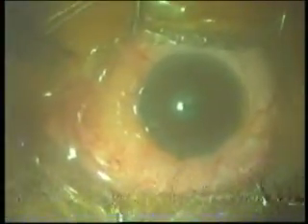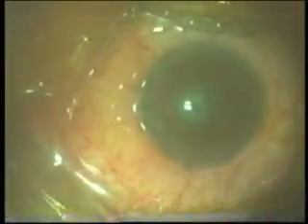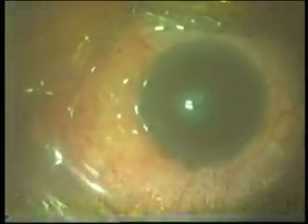After giving the block, the movement of the worm reduced to an extreme extent, and it was not as mobile as before, so maybe the xylocaine paralyzed the worm also. This was one of my first cases, and I was a little apprehensive about how it would go. You could still see the movements of the worm under the microscope.